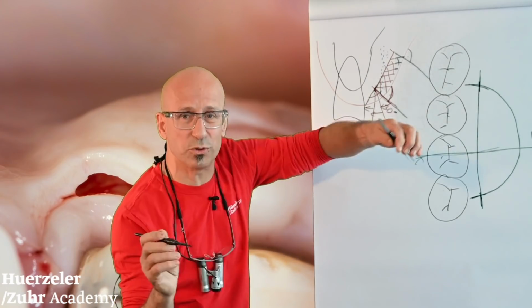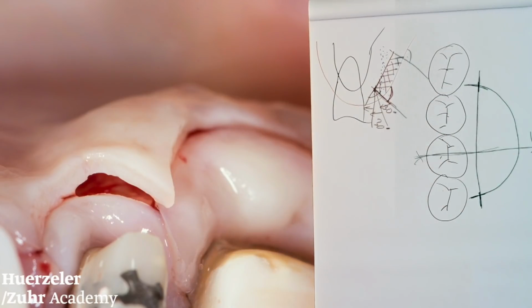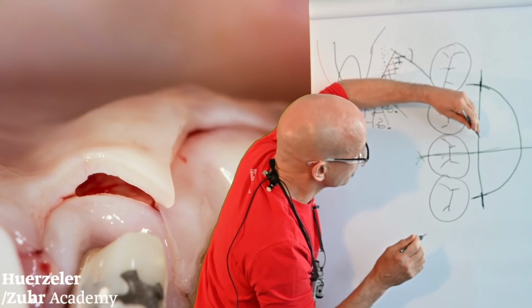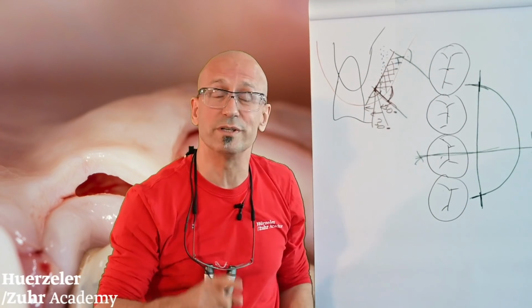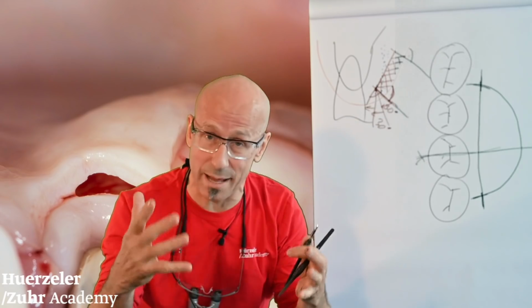So the moment you do that, as I said, and many like to do it like this, oh my goodness. So the moment, let me clean this up, no problem. The moment you take a forceps or a plier, you hold your graft here, and then you start to prepare. This is what you like to do. This is what you do. The moment you do that, I know exactly what's happening in your mind and what's happened clinically.